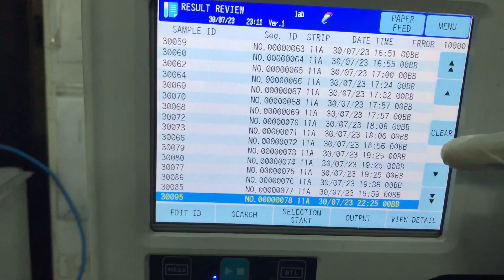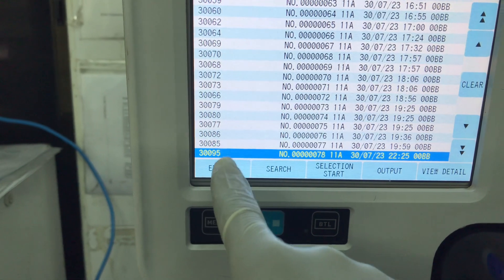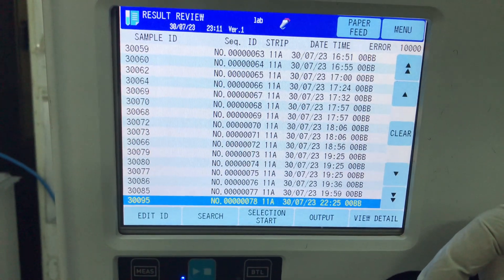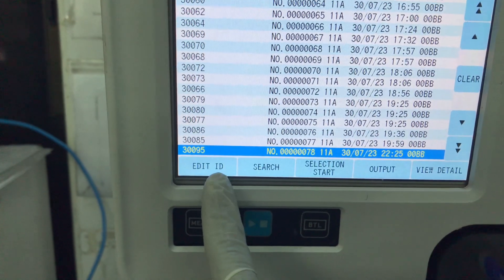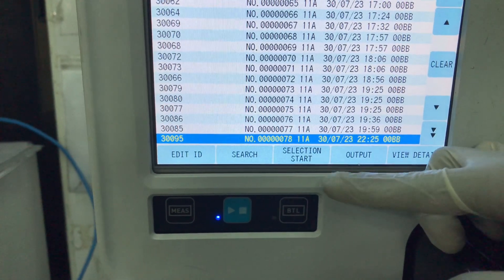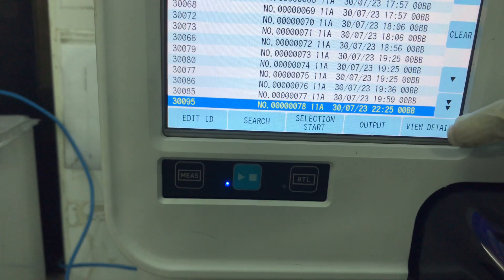It should take a while to actually produce the results. This is how the interface looks. When it's ready, it will appear after the last sample — the previous one we ran was sample 300-95. This number here represents the number of samples we have run today. Here you can edit the details, here you can search for previous results, and here is the selection start and selection end. Output is for when you want to print, and view details is when you want to actually view the details of the urine chemistry you just ran.